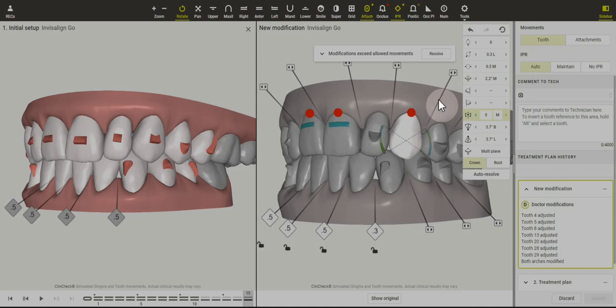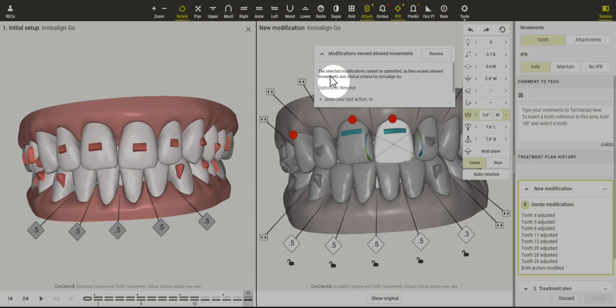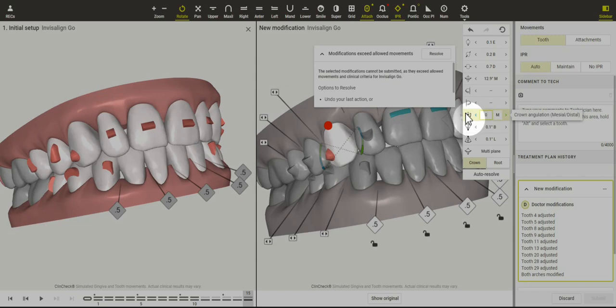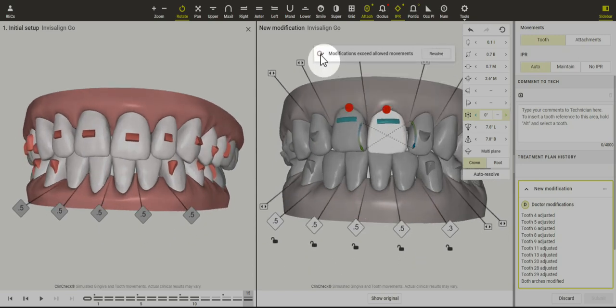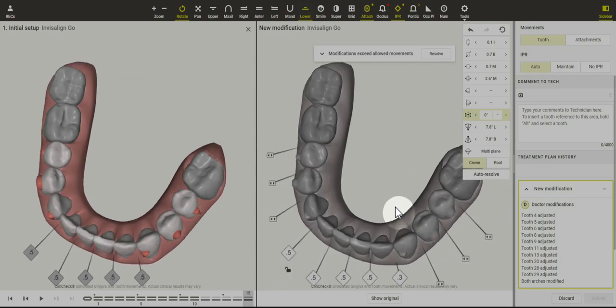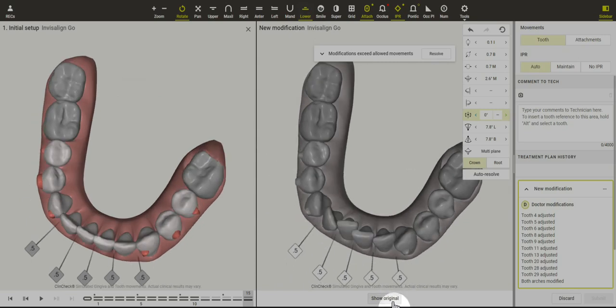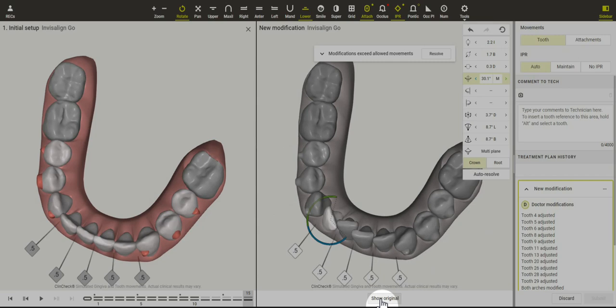Let me see what types of movements I can resolve here — good thing for the undo button. Maybe if we did less root movement, would that help? It's hard to tell exactly what the software wants here. I want to look at how these teeth are rotating — looks good. I'm going to try to do a little bit more rotation on some of them, just to try to over-treat those movements.